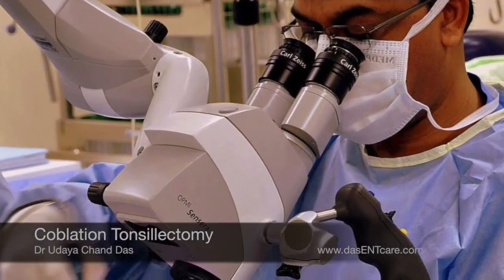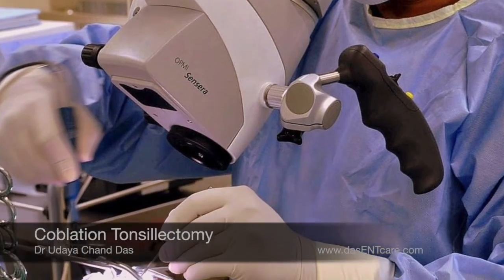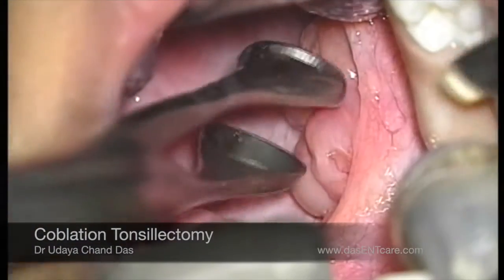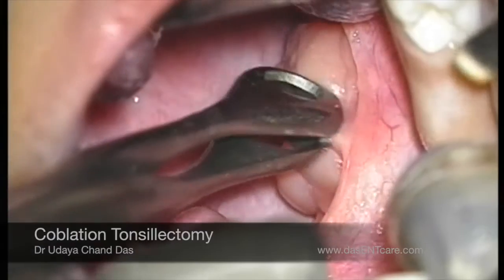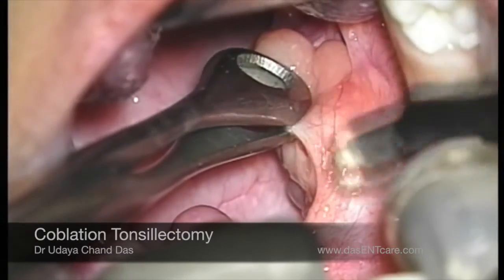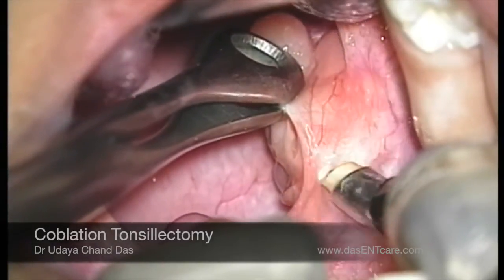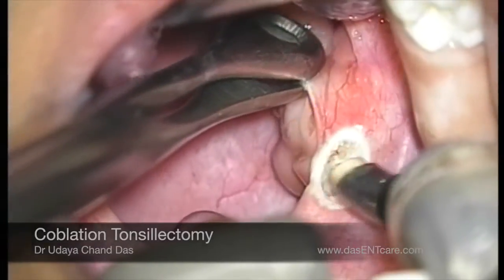This is the assembly — the microscope, the patient position, and the instruments. The surgery is done under microscopic vision, and that is the reason why I can achieve a bloodless field during the surgery.